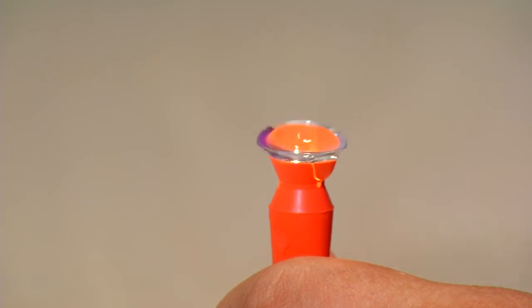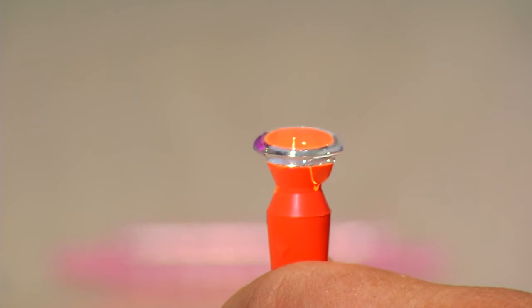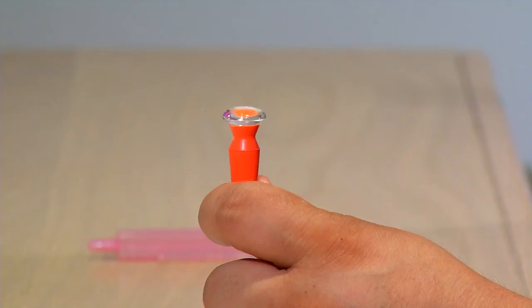Since tear circulation is limited when wearing a scleral contact lens, the preservatives found in soaking solutions remain in contact with the cornea for long periods of time. This increases the chance of an adverse reaction to the solution, so be certain to only use the solution recommended by your contact lens professional.